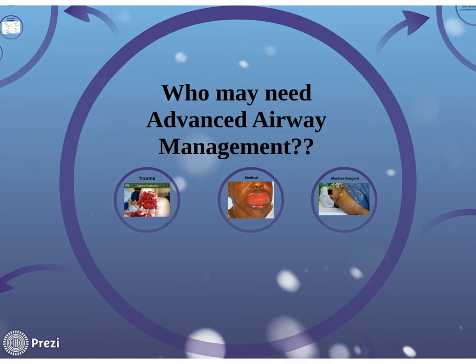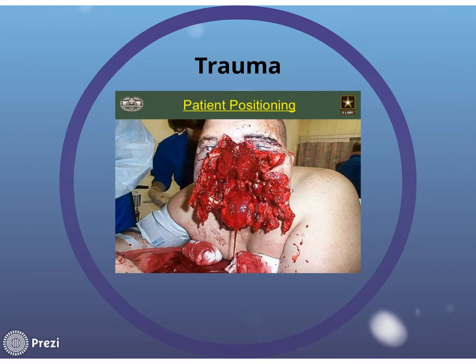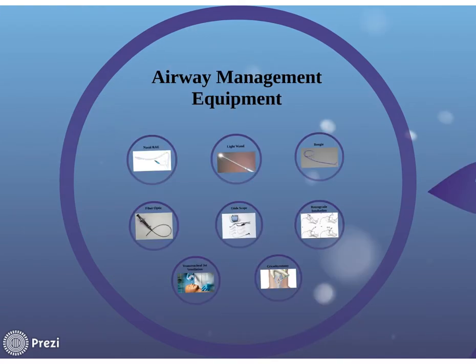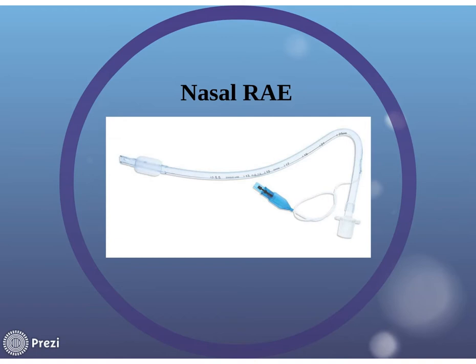Okay, some of the equipment. The nasal RAE tube. Of course, we use these for nasal intubations. What is the RAE? Is it right angle endotracheal tube? It's the names of the people that basically invented it. See, if you invent something, you get it named after you. It's awesome. This was a question at the College Bowl one year when I was at AANA.